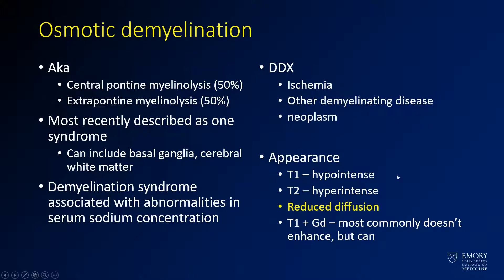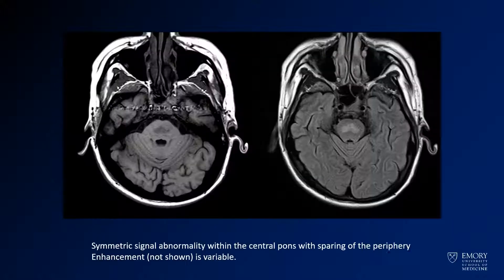For the imaging appearance, it tends to be T1 hypointense, T2 hyperintense, and have reduced diffusion. Most commonly there is no enhancement, although subtle enhancement would not be unusual. Here we see the case: there is a T1 hypointense region centrally within the pons. It's very symmetric and crosses the midline. Post-contrast images were not shown in this case, but it did not enhance.